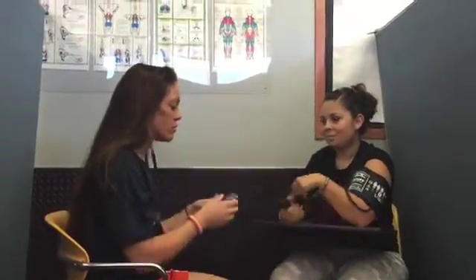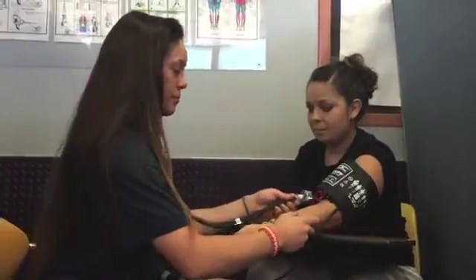With the stethoscope, you want to make sure that the earpieces are facing away from you. You want to make sure the stethoscope is on. You can tap it and you'll hear it to make sure it's on. If the stethoscope is not already on, you can turn it to make sure it's on. Once you hear the tapping in your ears, you're ready to go.